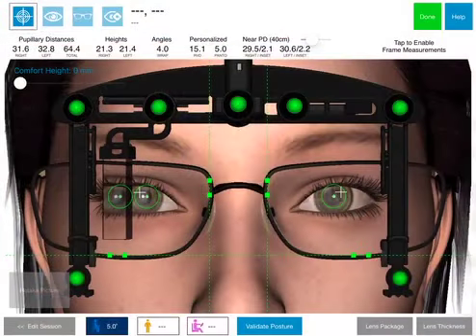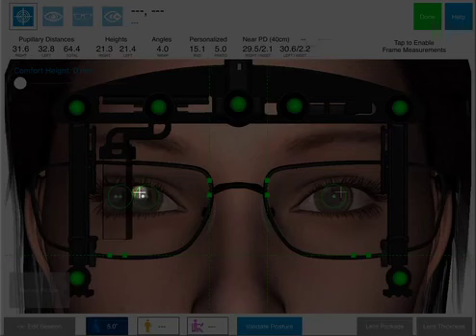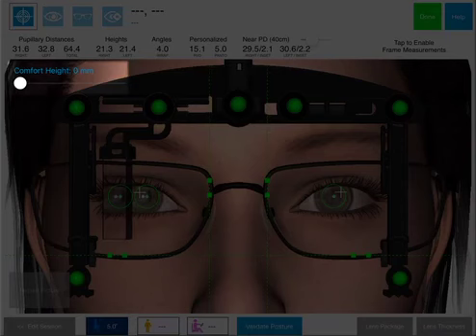The app will place the pupil markers based on the corneal reflection, but will measure fitting heights based on the final position of the white fitting cross. However, the optician can adjust the vertical position of the fitting cross based on their professional judgment and measurement habits by using the Comfort Height slider.